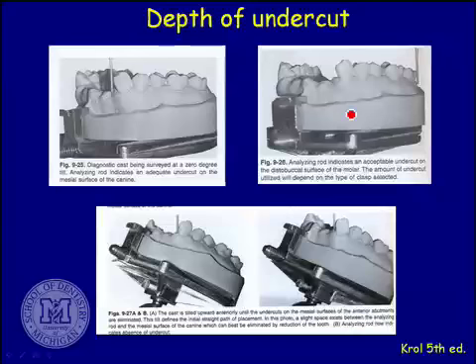If you're looking at your undercut, then what you want to see is basically, if this were a class 4 partial that you were going to do, this is just like the one that's on the cover of the Kroll book. So if you were saying, I want to go ahead and not show clasps in the front, if you had everything square with the world, you would say, okay, I got some undercut on the mesial proximal of these cuspids, for example. Cuspids or first bicuspids. The other thing you want to look at when the survey is level is to say, how much undercut do I have at that back tooth?